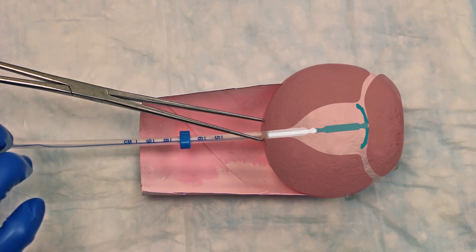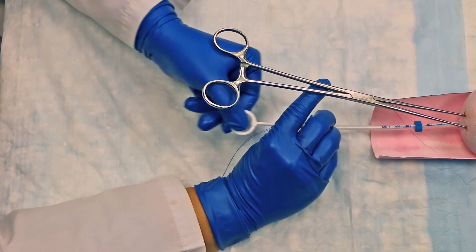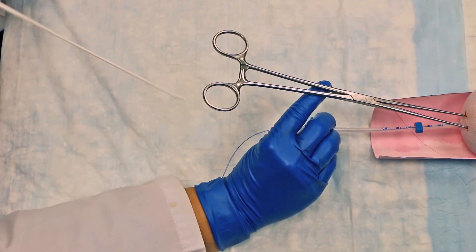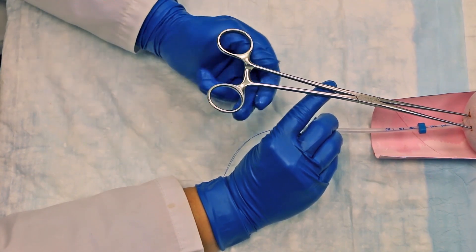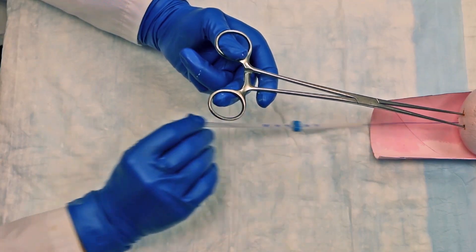Holding the insertion tube steady, withdraw the rod from the insertion tube all the way out to prevent it from catching on the knot at the lower end of the IUD. This could result in the IUD being dislodged. Then remove the insertion tube.